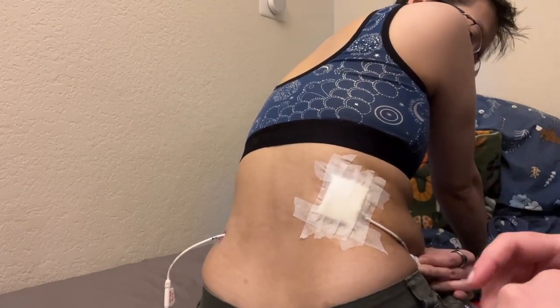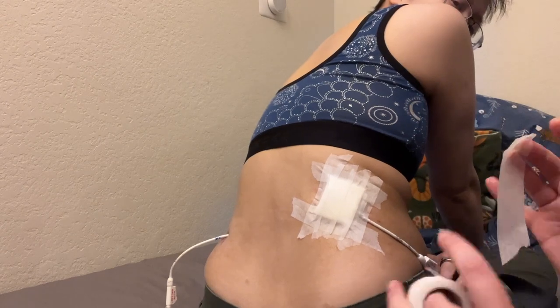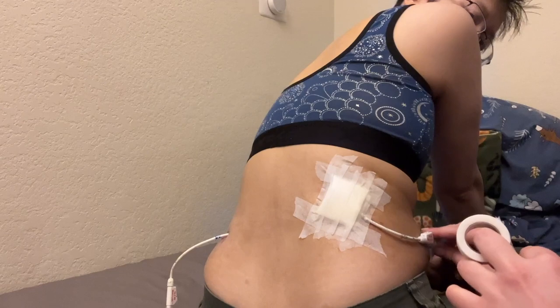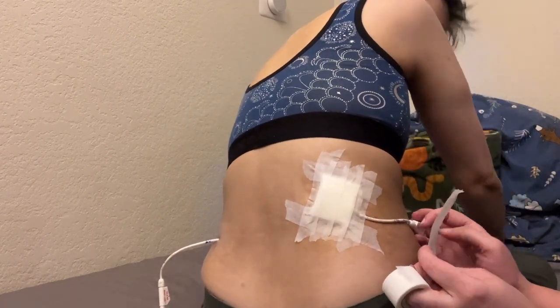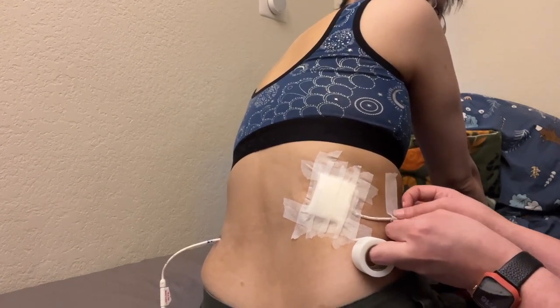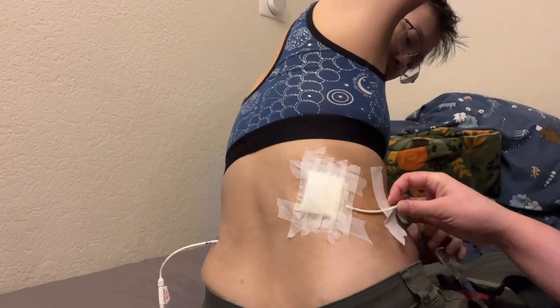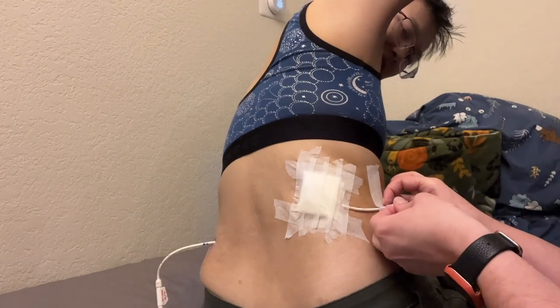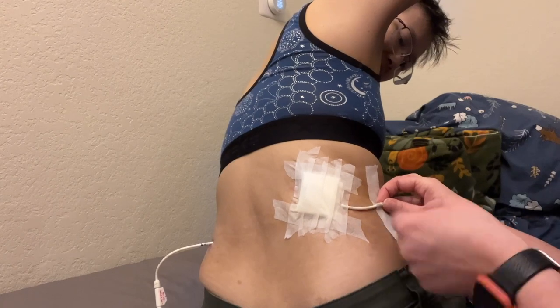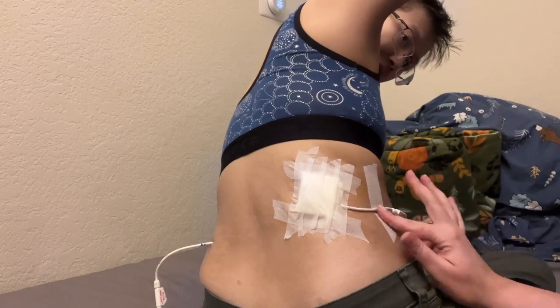The last step I do is a final piece of tape to anchor the tube where Mel wants it. I do this by putting it a little bit on the tube first, kind of looping it around the tube and then onto the skin, so that there's even less chance of this piece of tape coming off.